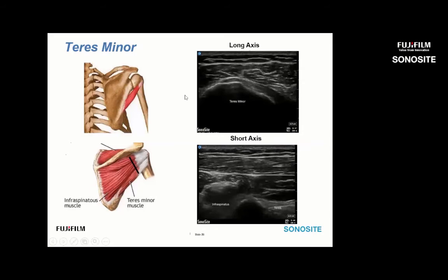Moving quickly to the teres minor: it comes up from the scapula and inserts onto the humerus. In short axis, we see the infraspinatus and teres minor together. We're usually not looking for a tear of the teres minor, but assessing relative echogenicity — in a patient with a chronic rotator cuff tear, looking for fatty atrophy of the infraspinatus versus the normal echo architecture of the teres minor. We can also compare to the overlying trapezius as a reference muscle for degree of echogenicity.